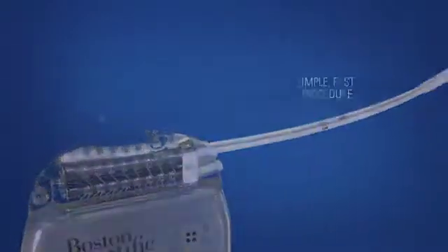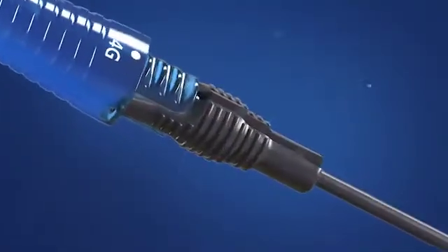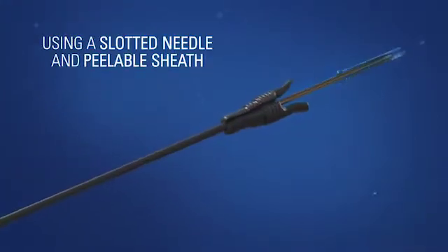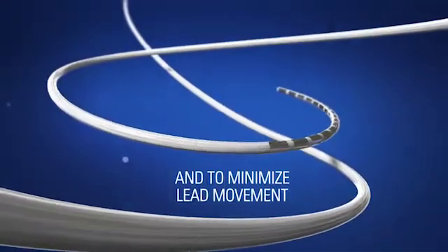Simple, fast procedure. Paired with the innovative Intrada needle — the first and only needle of its kind for SCS. Engineered with an ergonomic low-profile design for ease of use, using a slotted needle and peelable sheath. The Intrada needle is designed to enhance durability and minimize lead movement.